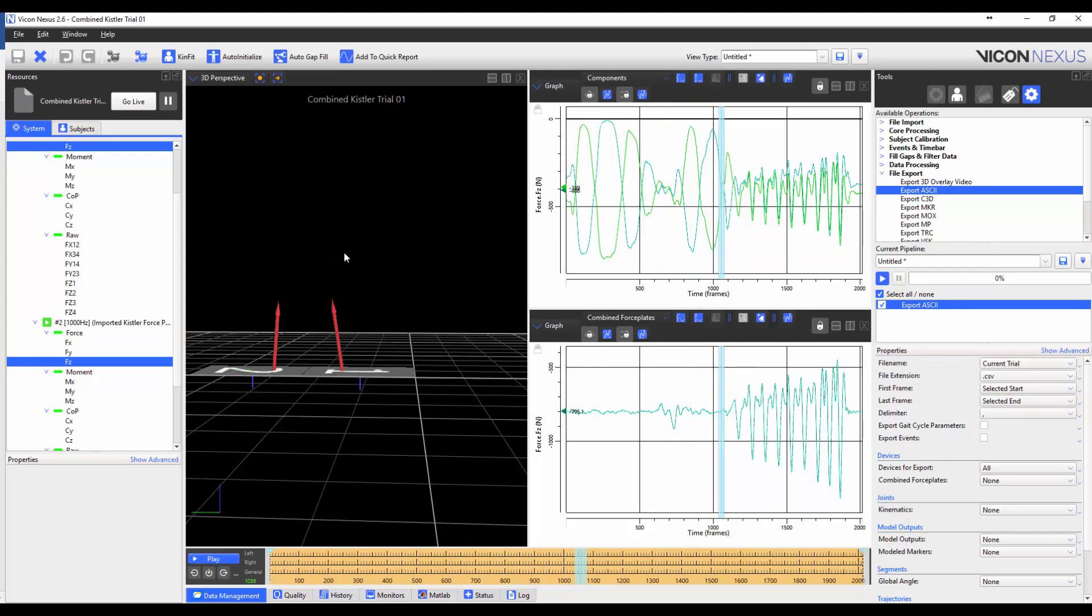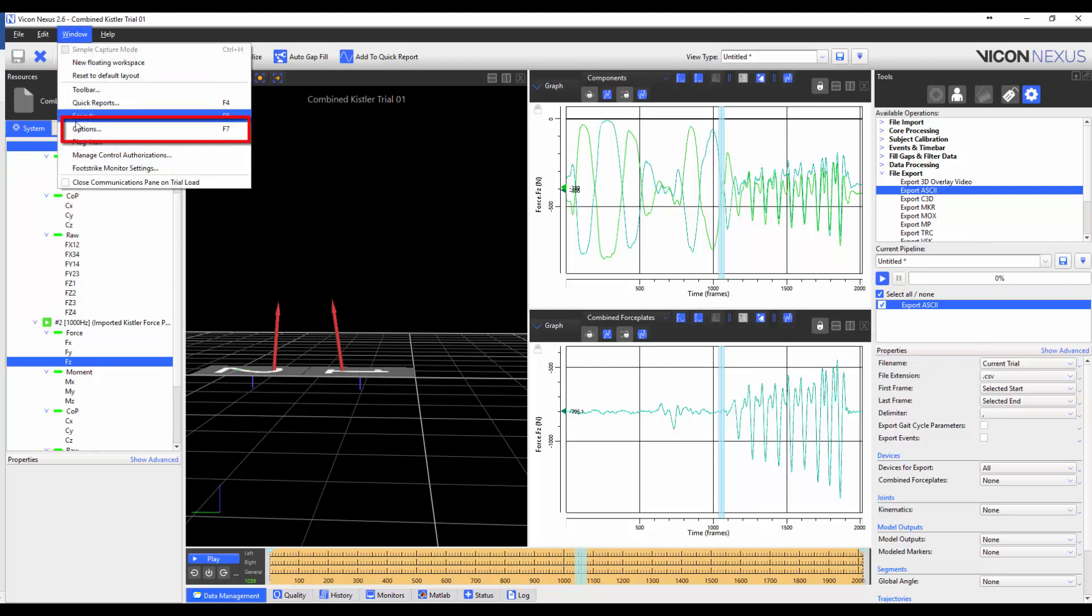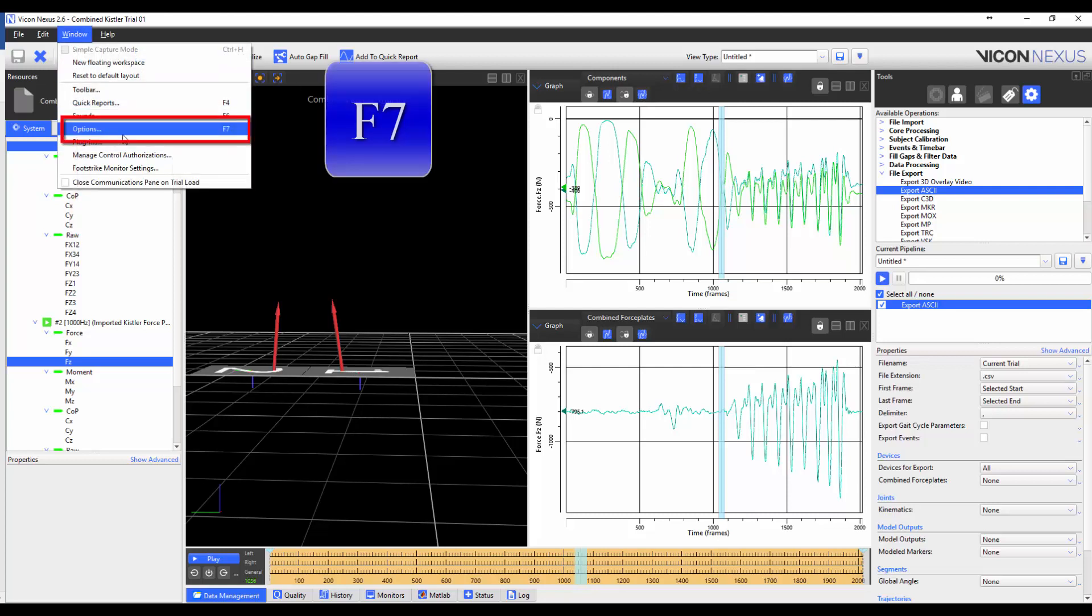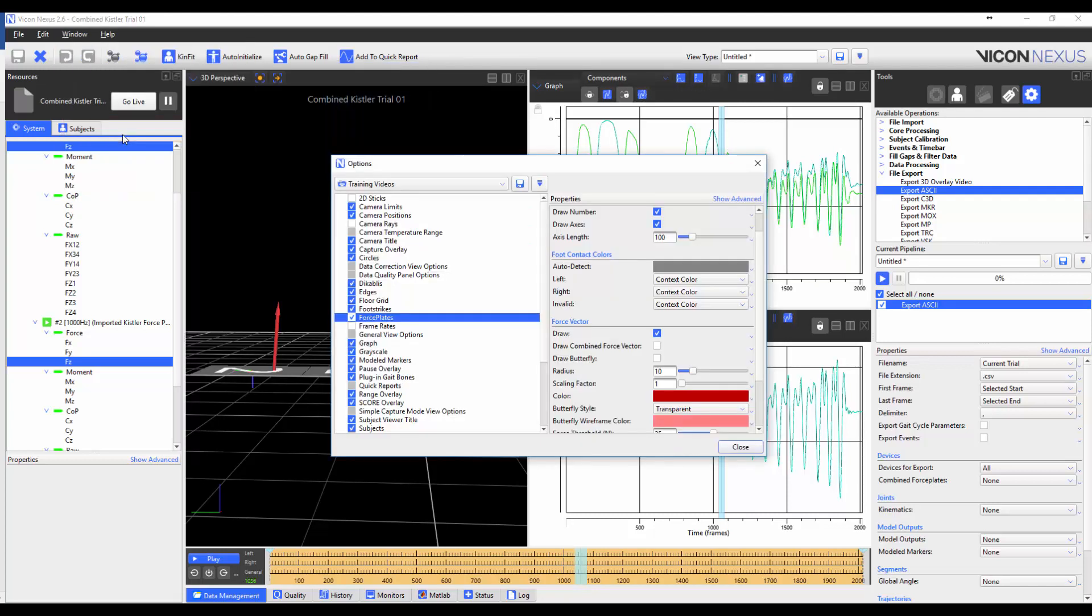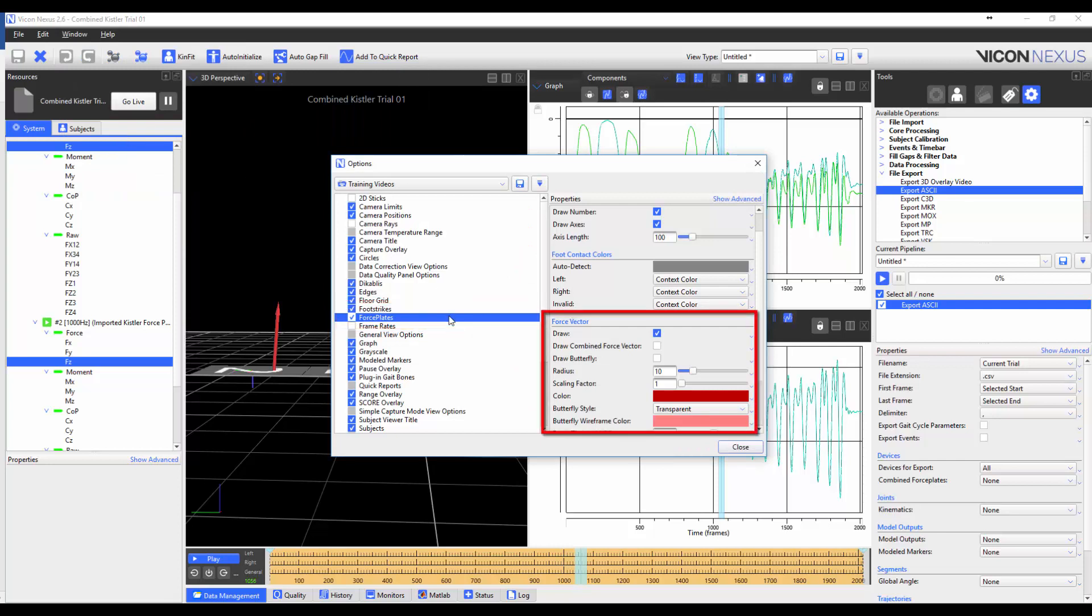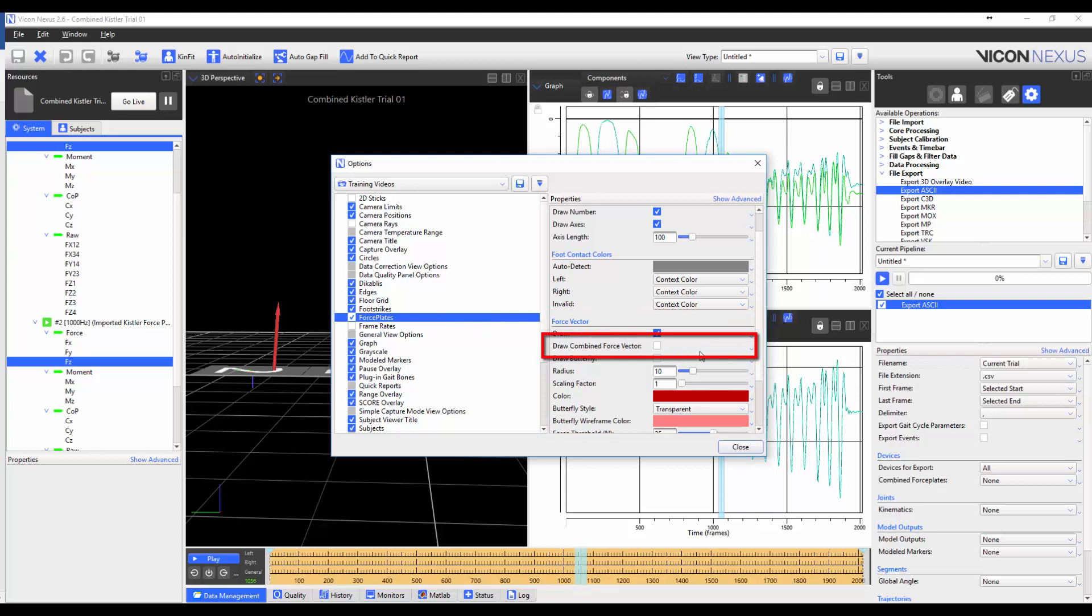You can also visualize the combined force vector by going to Window, Options, or by pressing F7. Selecting the force plates, and then under the heading Force Vector, checking the box Draw Combined Force Vector.